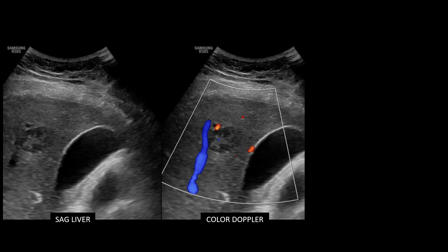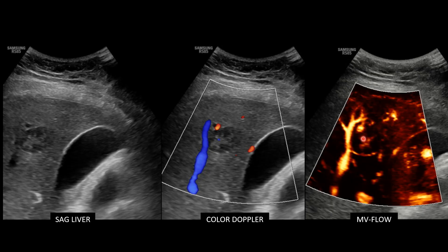Now, if we look at a third example, you can see this FNH is more hypoechoic compared to the others, but it does have an echogenic central scar with some mild internal vascular flow on color Doppler imaging. When we add MV flow, that stellate or spokewheel appearance is brought out a bit further, consistent with FNH. And this was confirmed with additional imaging. And just to clarify, MV flow is still part of our conventional ultrasound evaluation. It's extremely helpful, but we can get even more information about a lesion with the use of contrast-enhanced ultrasound.